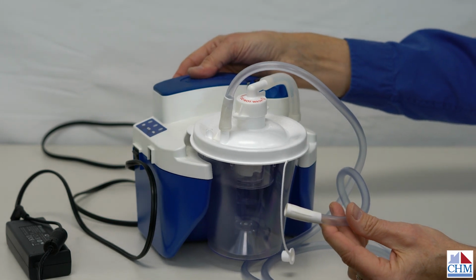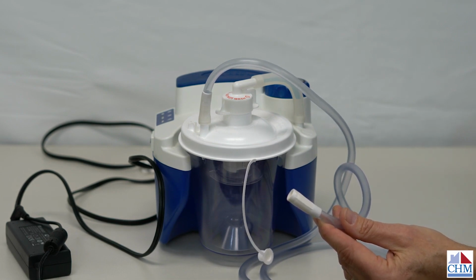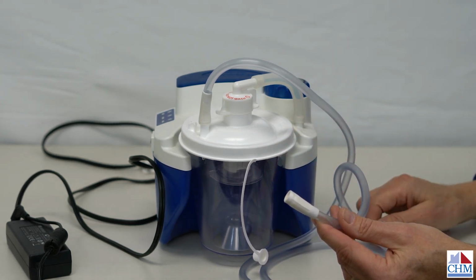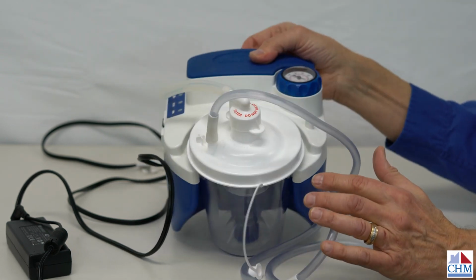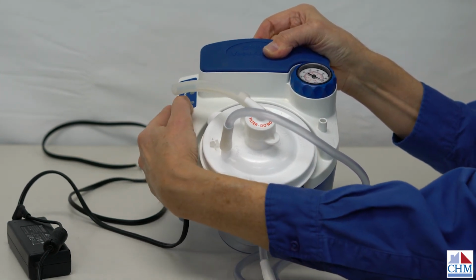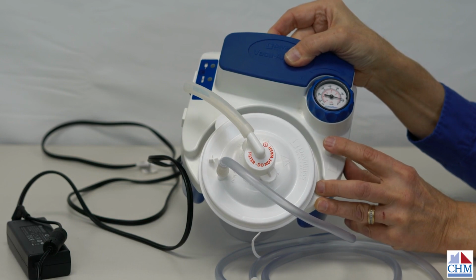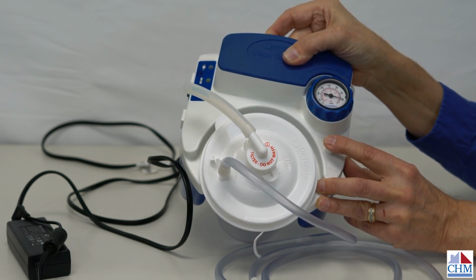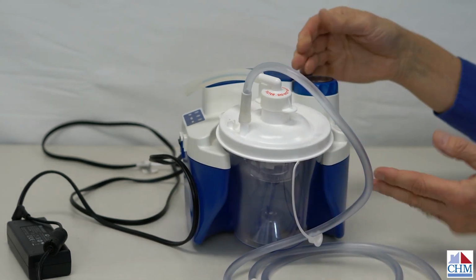If you ever have trouble with the machine, let's say you come on shift and you're going to use the machine, or somebody told you that it's not working, the easiest thing to figure out first is, is it a problem with the canister, or is there really a problem with the machine? So the easiest thing to do is to disconnect the canister from the machine itself, so that you just have the inlet left here. Now I can go ahead and turn the machine on, and I can see if I can get suction, and I can test it by putting my finger over here. So if I see now that I'm getting suction pressure from the machine, that tells me the machine is working properly, and then I can focus my attention on probably a filter problem or a canister problem.